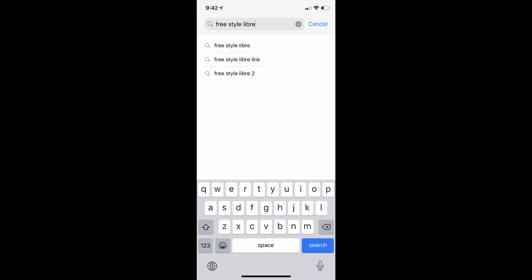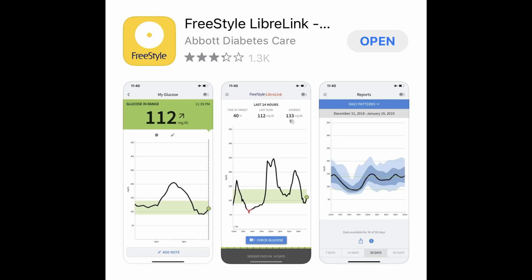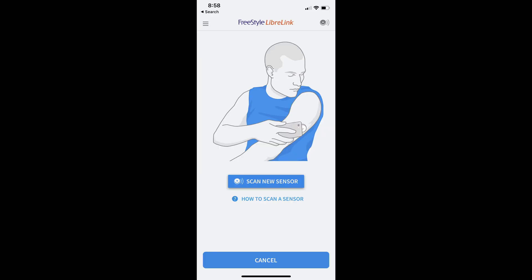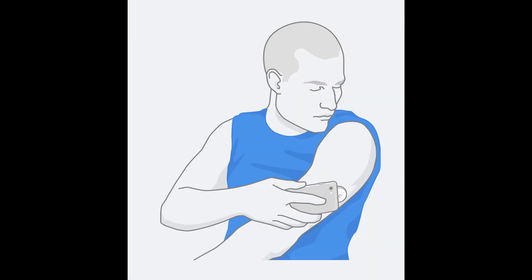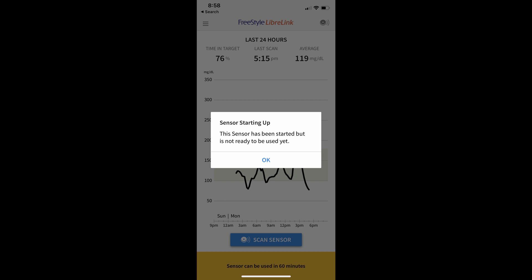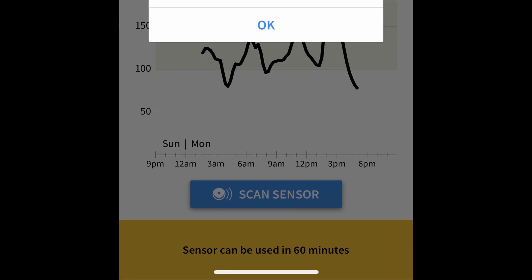Now let's go over to your smartphone. I'm using an iPhone in this example. Go to the App Store and type in FreeStyle Libre, then you'll see this app — download the FreeStyle Libre app. Once downloaded you would be ready to scan your sensor. When you open the app for the first time, it will ask you if you want to scan a new sensor. Go ahead and click 'Scan New Sensor,' then bring the cell phone close to the sensor as shown in the picture and it will scan your sensor.